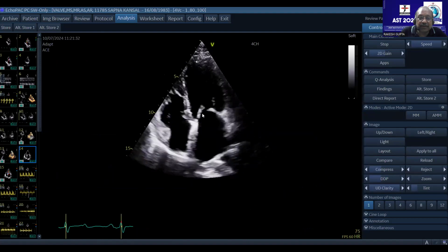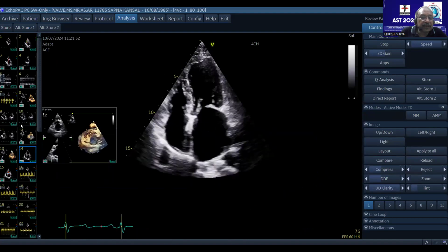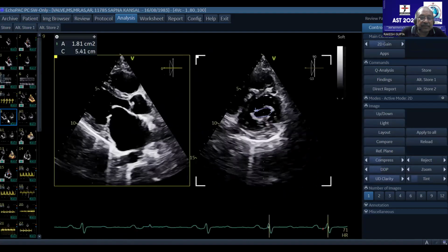How to get the mitral valve area in SAX? In SAX we cut and get planimetry. SAX means short axis view at mitral level. This is a multi-dimensional image, which is derived from either 3D in GE or X-plane in Philips.